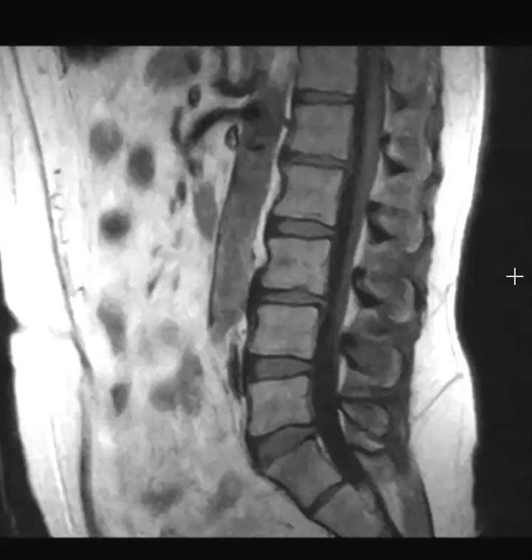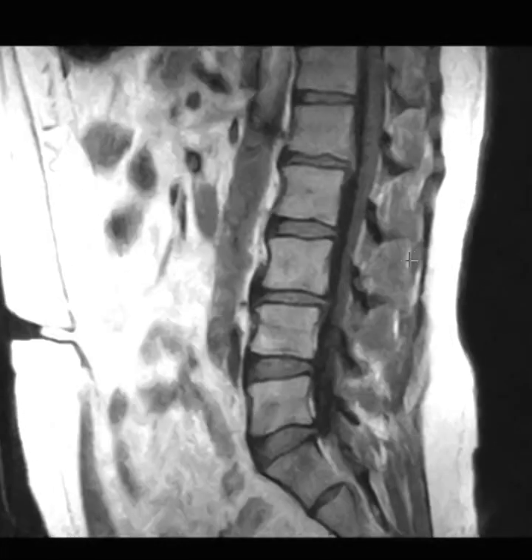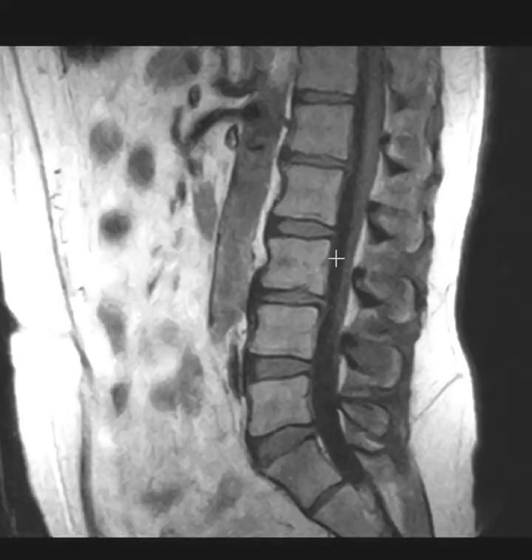Hello, this is Dr. Gay from First Look MRI, and this is a 53-year-old male who complained of numbness and tingling from his pelvis all the way down through his legs to his feet, and he had had falls because of the symptoms. He went to his doctor, and they were worried that he may have a disc herniation of the lumbar spine or something causing his bilateral lower extremity symptoms and weakness in the legs.